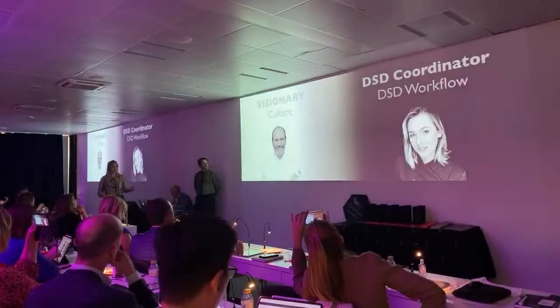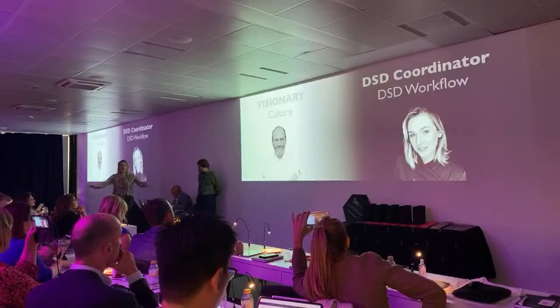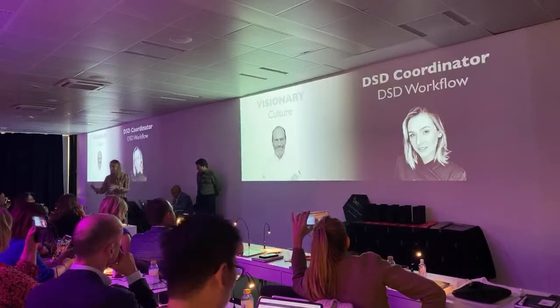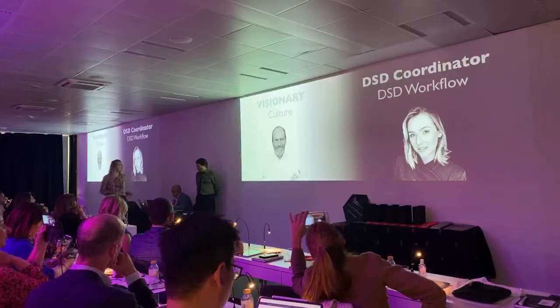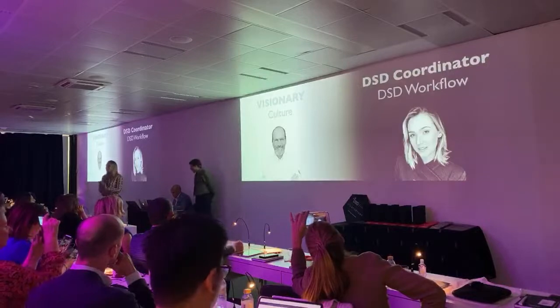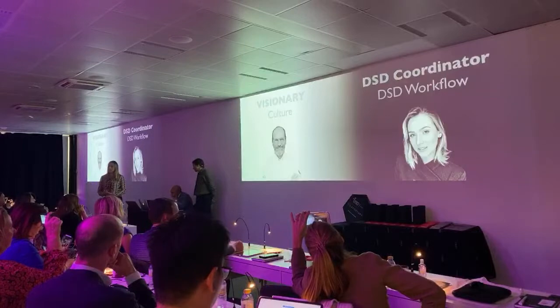Actually, we did this at the Well Clinic. And practice everything: where you're going to go, where the assistant needs to be standing, what she needs to do at every step. They write it down. And this is what the DSD coordinator actually does, to make your life easier, because we are trying to help teach your staff members to do this with you, okay?